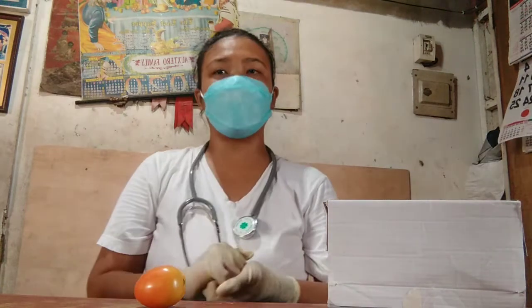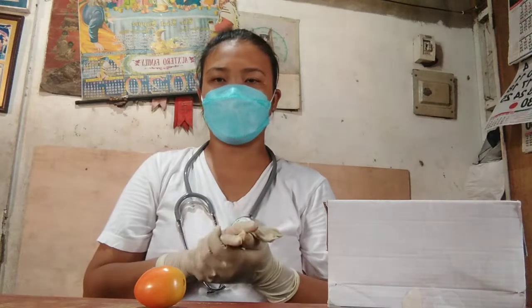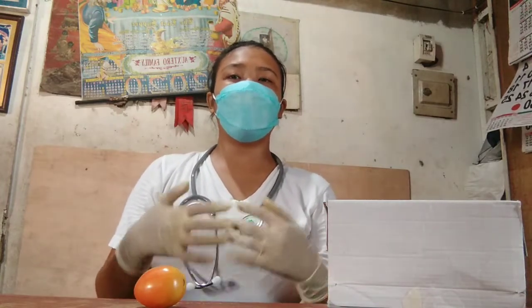First, perform hand hygiene and observe the appropriate infection control procedures to prevent cross-contamination and transmission of microorganisms. Next, prepare the medication from the vial or ampoule for drug withdrawal. I'm done preparing the vial or ampoule for drug withdrawal. We proceed to provide the client's privacy, which provides the client's comfort, and it is their basic right.